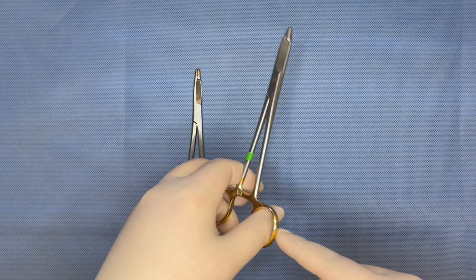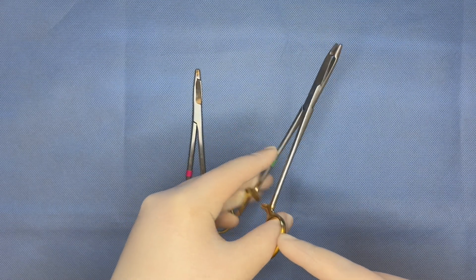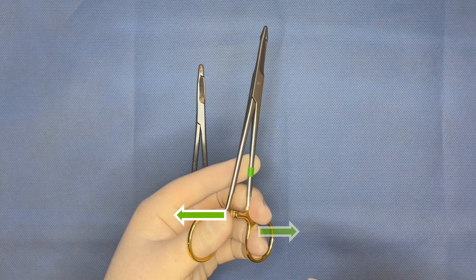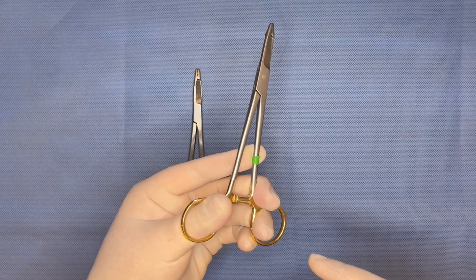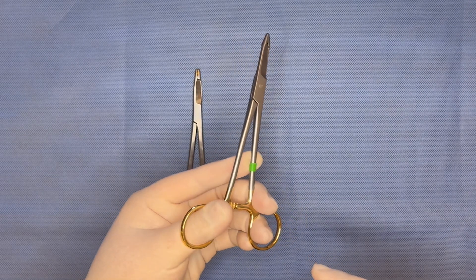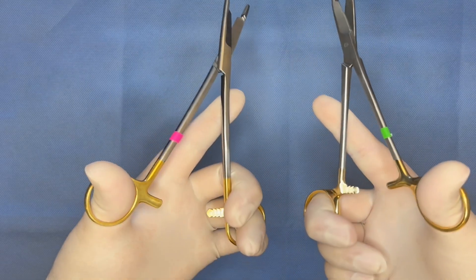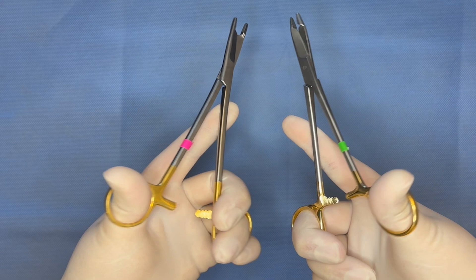If I want to use a right-handed instrument in my left hand, I instead need to pull my thumb towards my palm and push away with my fingers. This is effective but less ergonomic and requires more conscious practice. Using the correctly designed instrument for each hand is smoother and more natural. I like to have the option to use left-handed needle drivers for closing large incisions or when more precision is needed, but I often use the standard instruments for smaller incisions.